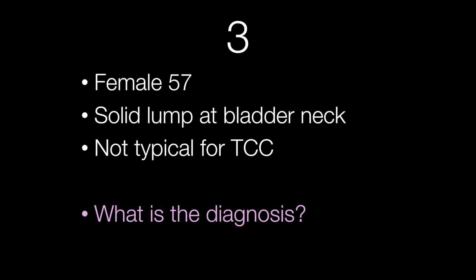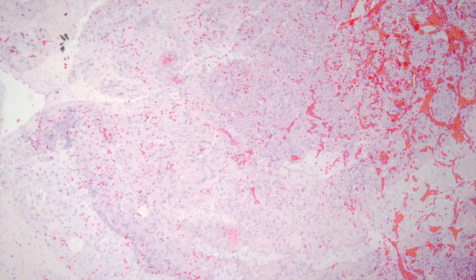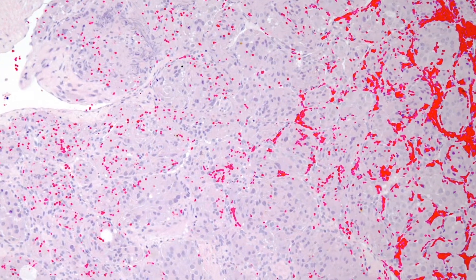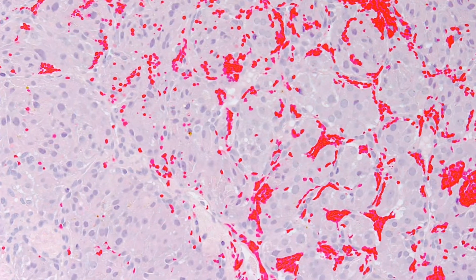Case number three is from a female of 57 with a solid lump at the bladder neck. It does not look typical for a TCC. So what is the diagnosis? Starting off with a low power view, you can see the abnormality on the right side of the picture — there's a bit of a clue for you. Here are some higher power views.